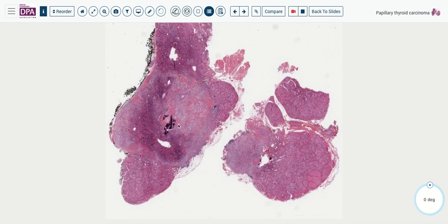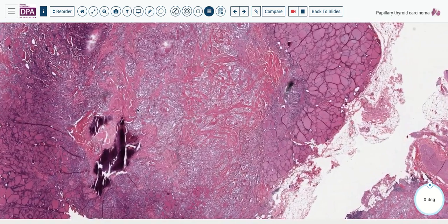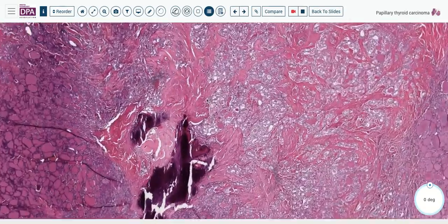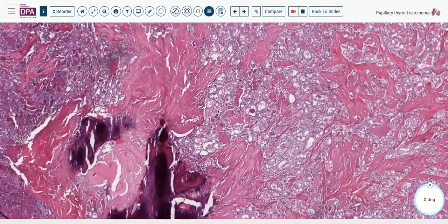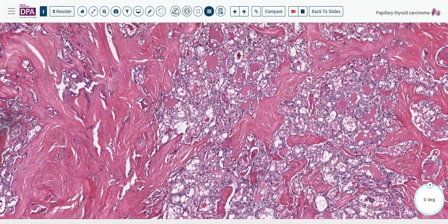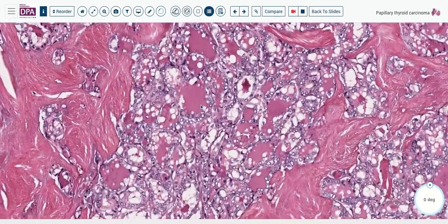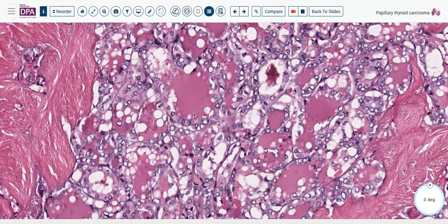Here's another example. Here we see at low magnification this calcification and some of the sclerosing appearance of this tumor. You can see the very dense hyalinization. And so sometimes you will be tempted to wonder, well, is there amyloid here or something like that? That is a consideration if you're thinking possibly of medullary carcinoma. But medullary carcinoma has different nuclear features.